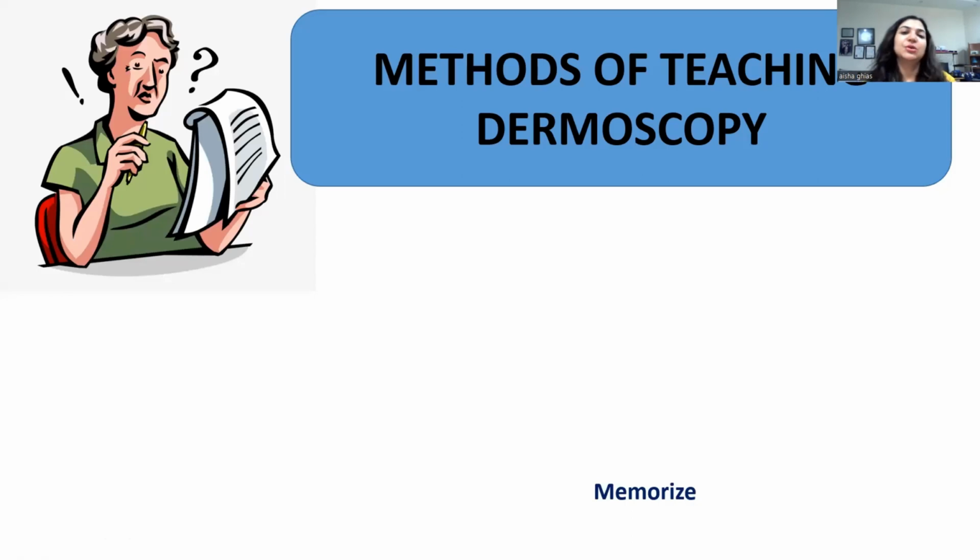So how do I teach dermoscopy? There are so many methods by which we teach dermoscopy. And this is one of the areas of concern for some novice who doesn't know the ABC of dermoscopy: which method are we going to prefer in order to make you better understand the dermoscopic nomenclature, terms, and features, and make you able to diagnose properly what is there in the dermoscopic images.